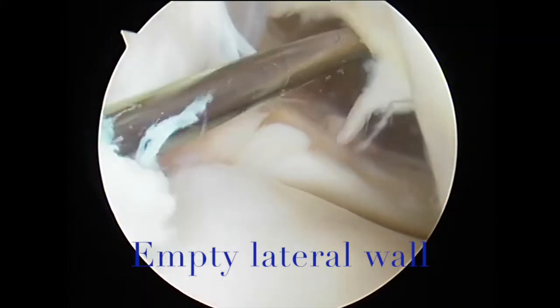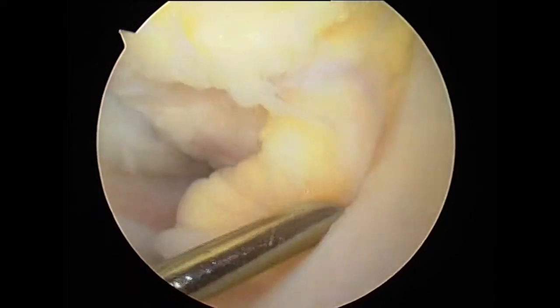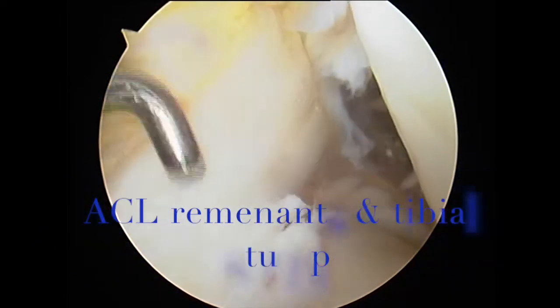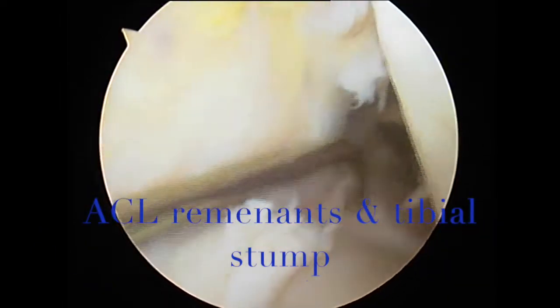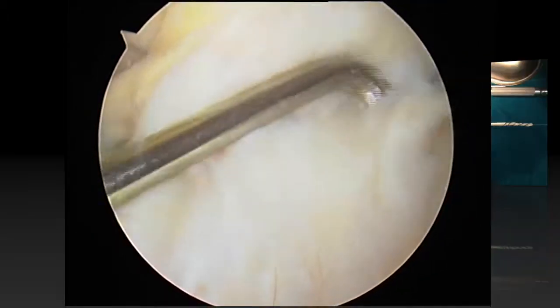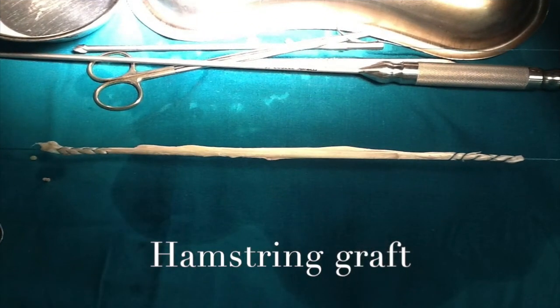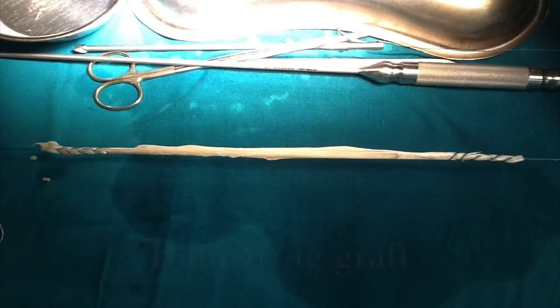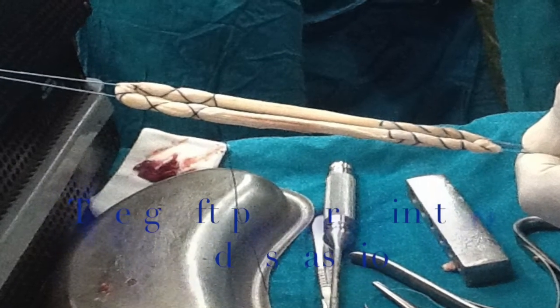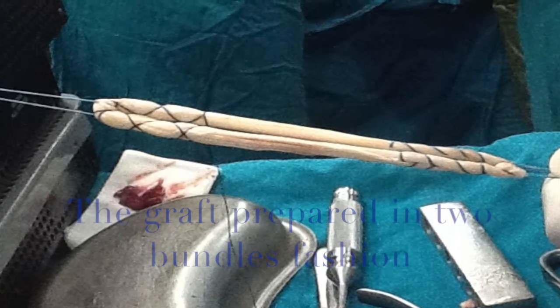This is a case scenario for someone who has had an anterior cruciate ligament injury. You can see the empty lateral wall and the remnants of the anterior cruciate ligament still attached into the tibial footprint. The hamstring tendons have been harvested — both the semitendinosus and the gracilis — and been repaired into a fashion that would replicate the two bundles of the anterior cruciate ligament.